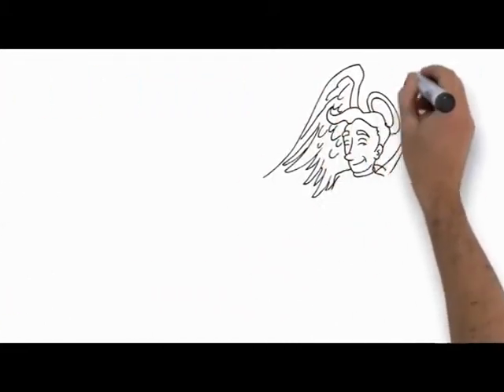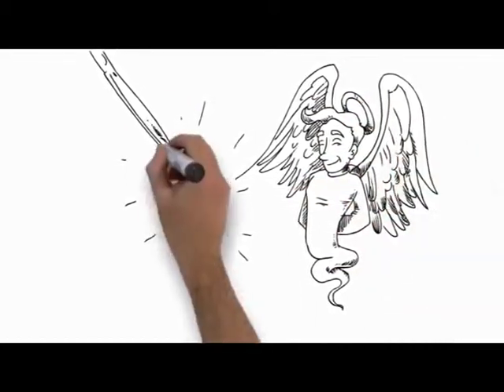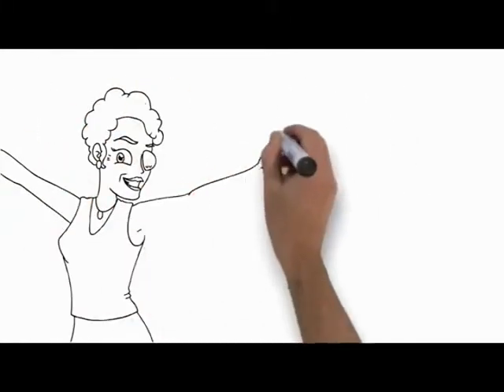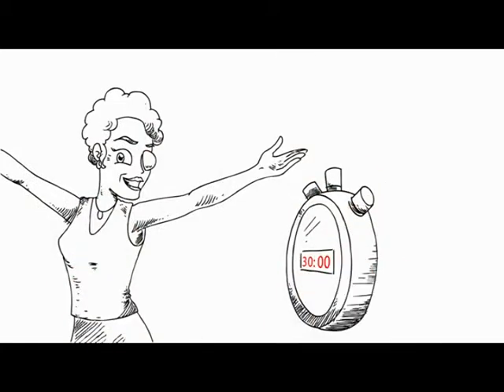In all cornea transplants, the new tissue comes from someone who is kind enough to become an organ donor. The donated cornea is rigorously tested to be certain that it's safe. The DSAEK cornea transplant is performed as an outpatient procedure. It takes about 30 minutes and then you're on your way.